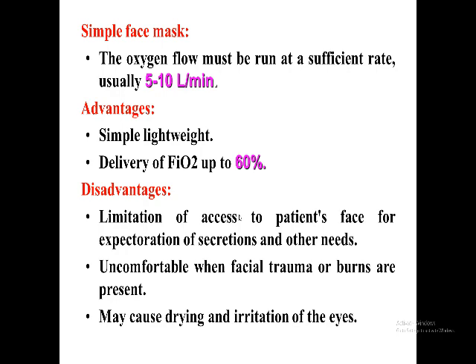Disadvantage, the limitation of access to the patient's face. The patient is not as comfortable with the face mask as with a nasal cannula. The patient may vomit into the mask and re-aspirate his secretions. It is uncomfortable, especially if there is facial trauma or burn, and causes dryness and irritation of the eyes.